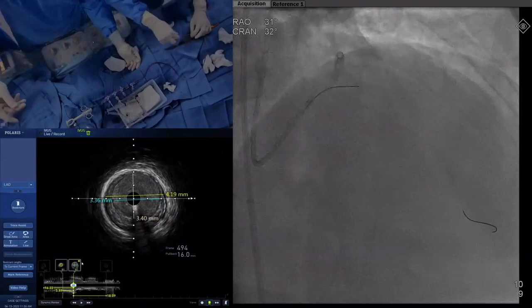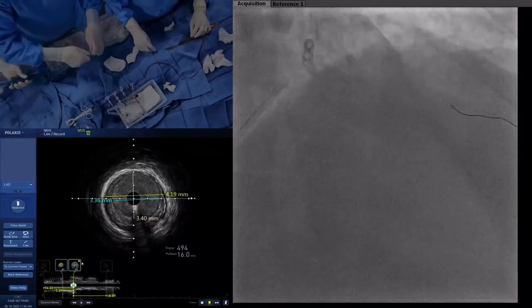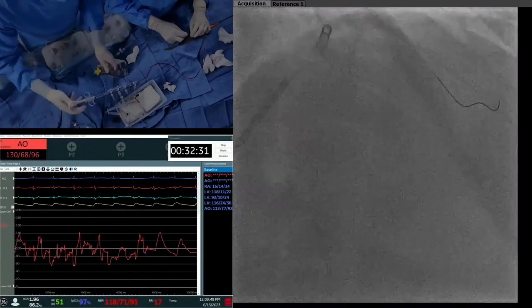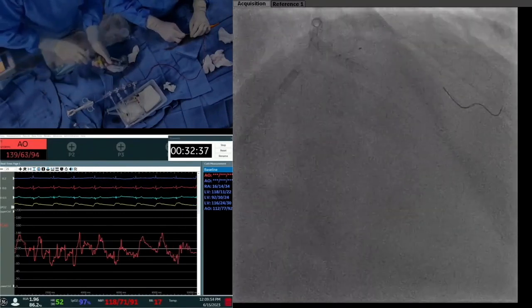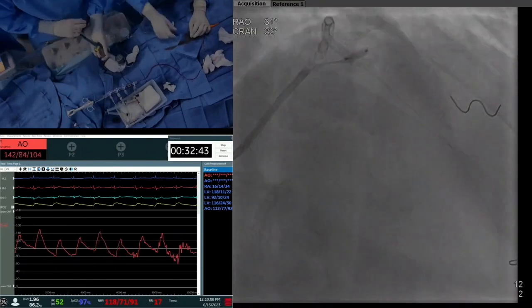So going back to the other criteria, just like La Sala mentioned, if you see the diagonal, the lesion is long. It's not just the ostial diagonal. It has some disease going up here. So this is a 2.5 cutter.